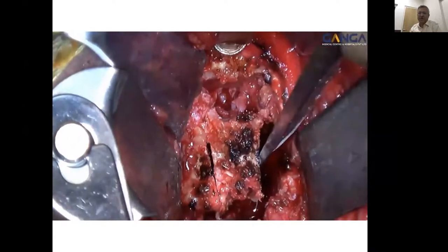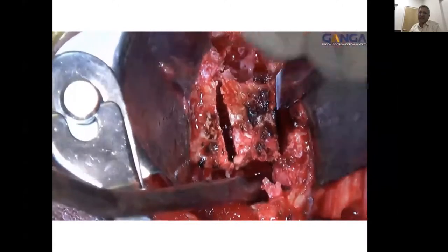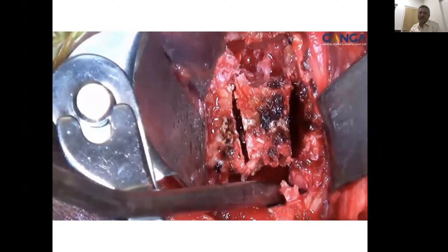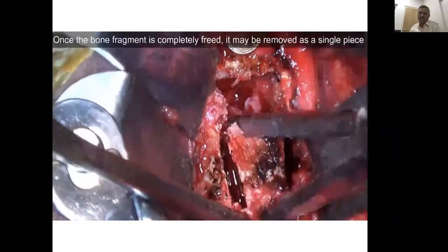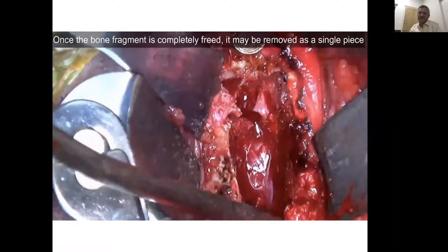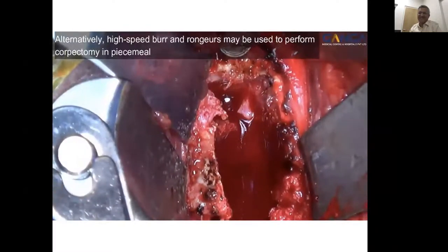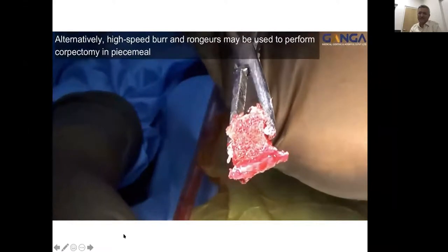I'm just showing. This is what I meant. You can use an osteotome to complete the break, and you can appreciate the movement that is happening. For doing this procedure, especially quite comfortably, you have to be sure. It's come out completely. You can see that. Yes, with the PLL. Okay, you can hear Bharat's voice also. I'm not taking credit for it. I told Bharat I'm going to send him the video.